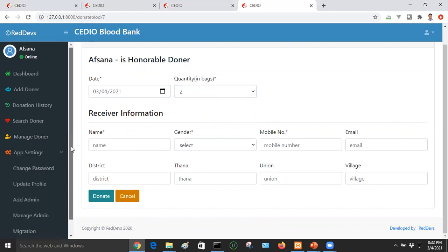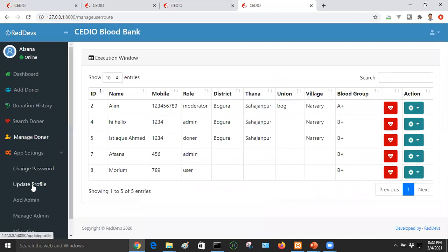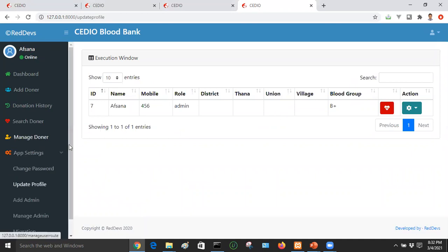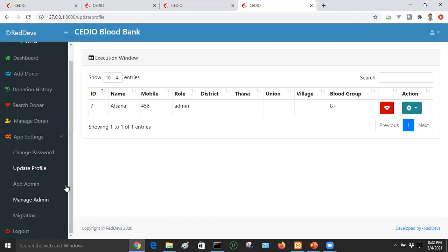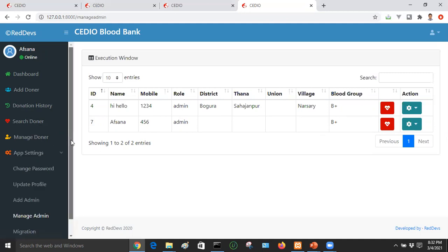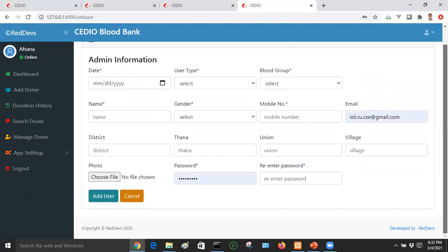You can access app settings, including password change and update profile. You can also add a login profile and manage migration. In the manage admin section, you can manage the admin panel and create password changes. You can access the admin panel and manage admin accounts.